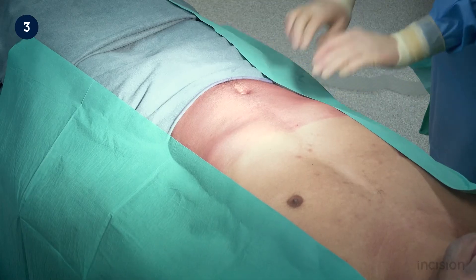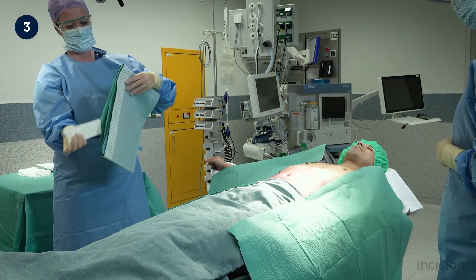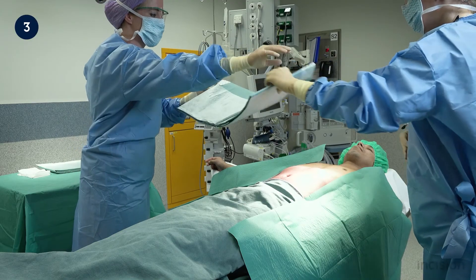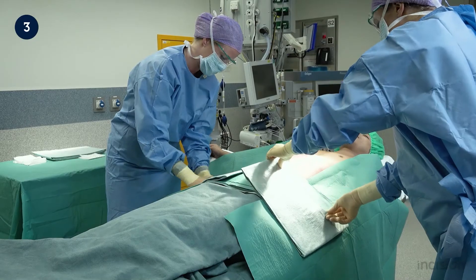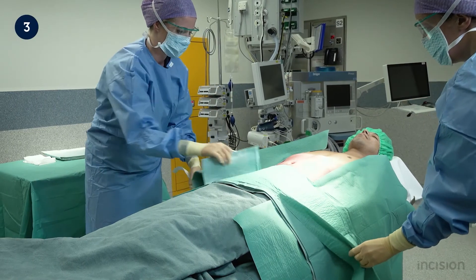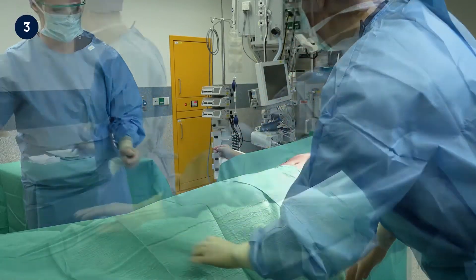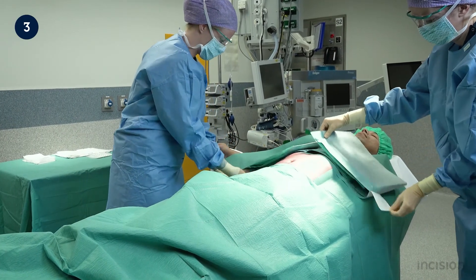Two sides of the square configuration are now in place. The scrub nurse and surgeon now work together to unfold a larger drape, their coordinated actions intended to minimise the risk of contamination. In contrast to the smaller drape, this larger drape is first applied. The additional adhesive strip cover is removed, sticking it to the smaller drapes underneath. This larger drape is then unfolded, extending the sterile field. Another large drape is used to perform the same action, and completes the creation of the square draping configuration.